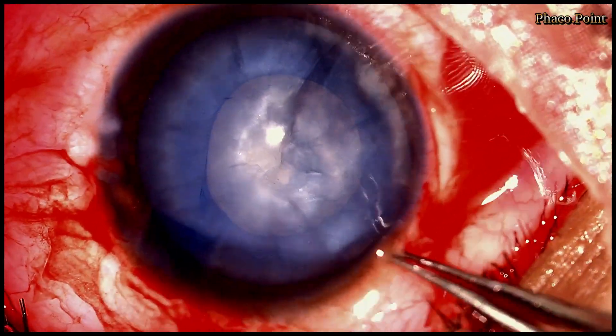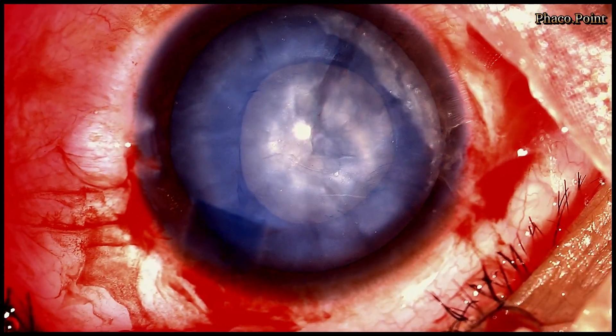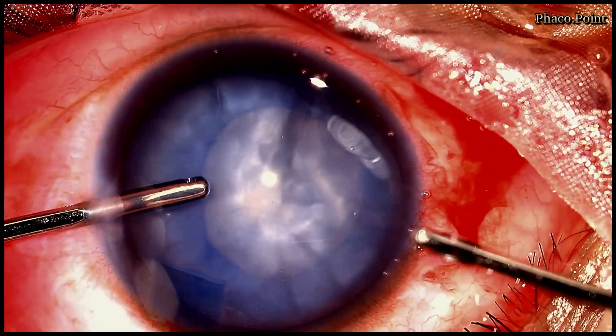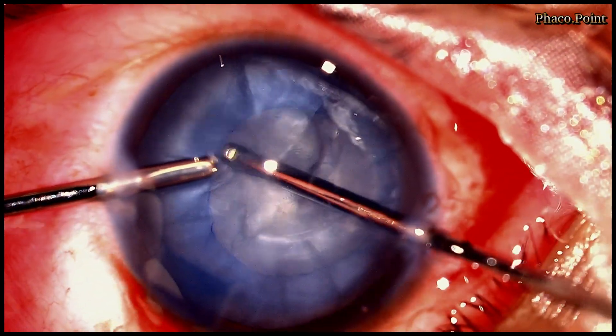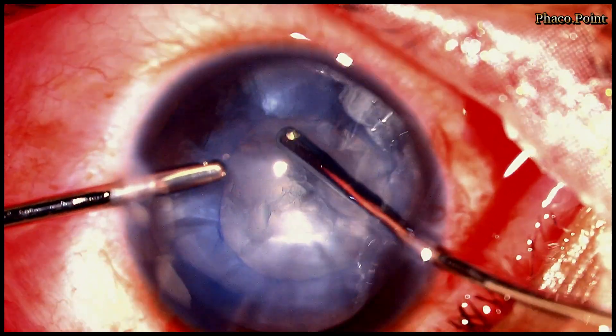Now as you can see I have completed the rhexis. I now proceed with a bimanual irrigation aspiration to aspirate the rest of this soft cataract which has occurred as a result of trauma in this young patient.